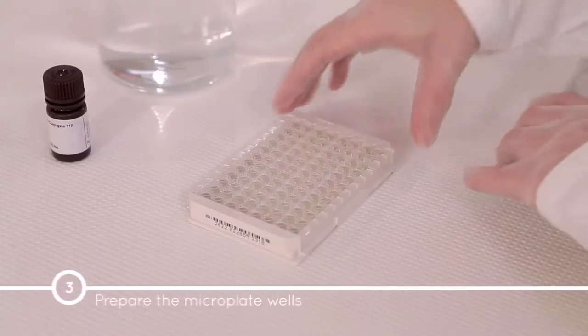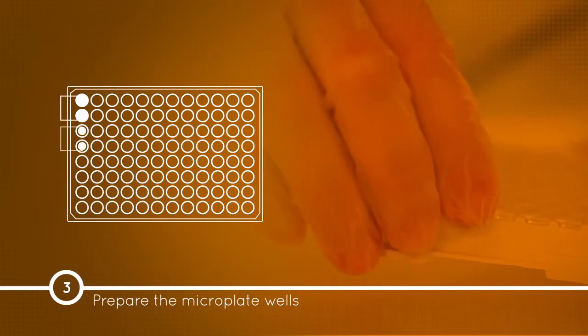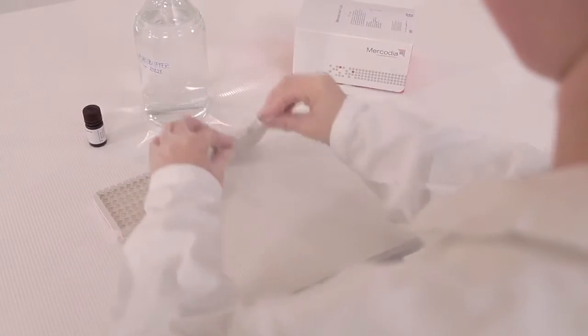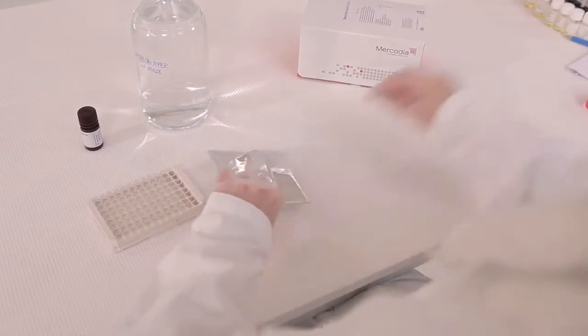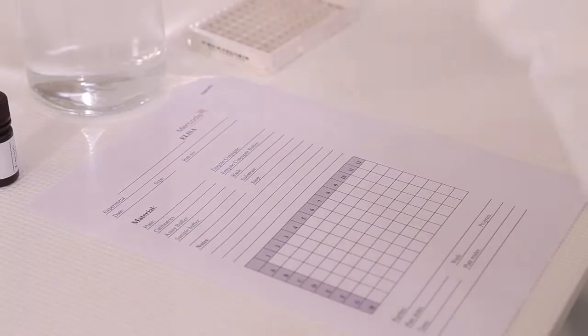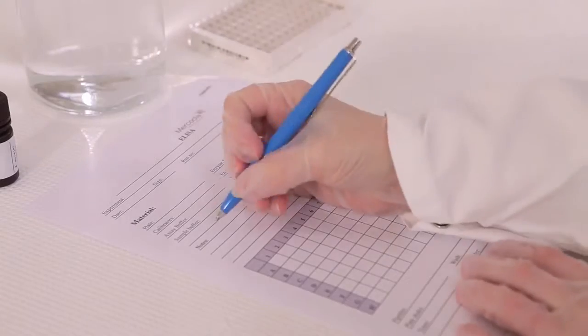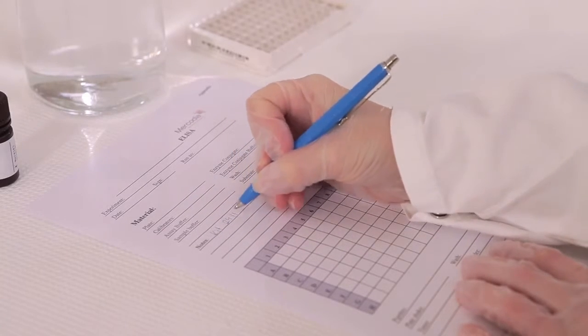Prepare the microplate wells to accommodate calibrators, Mercodia antigen controls, and samples in duplicate. Unused strips can be removed and stored in a sealed bag for 2 months. It is useful to have a worksheet to plan and record details about your run. Note the lot number for the kit and designate wells for the calibrators, controls, and samples.